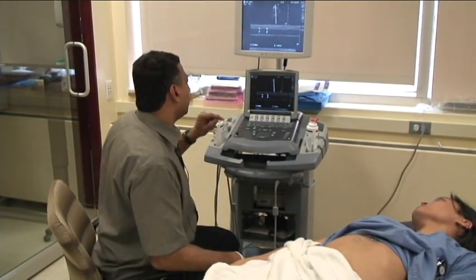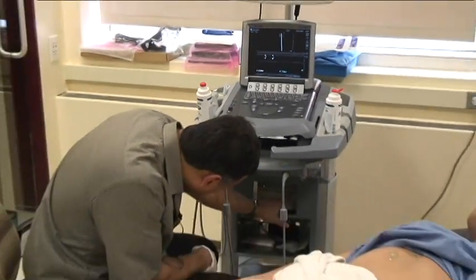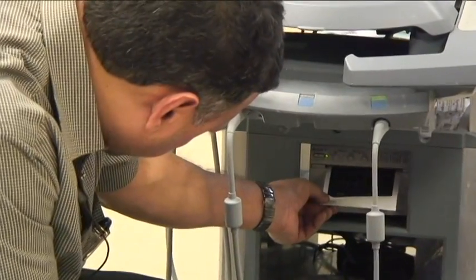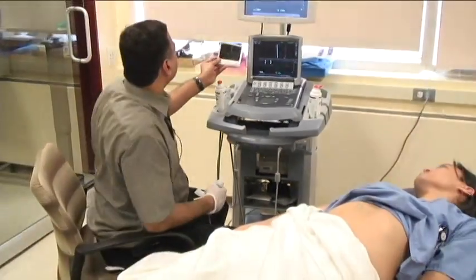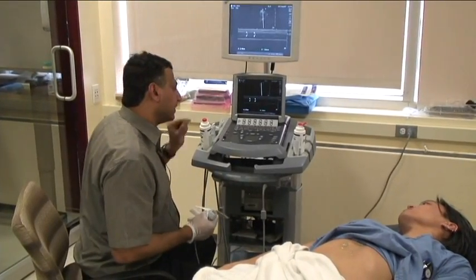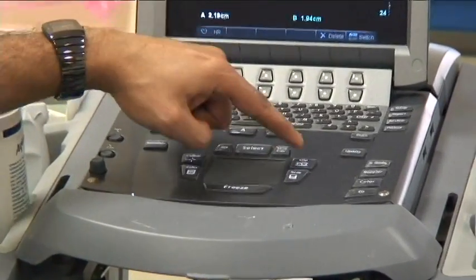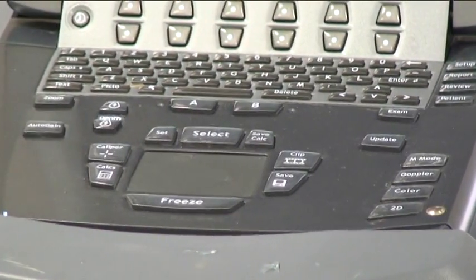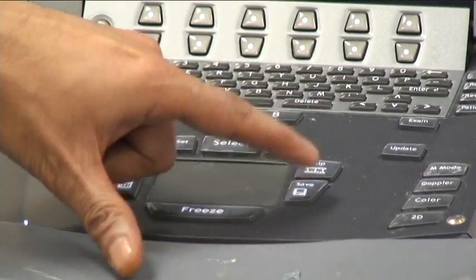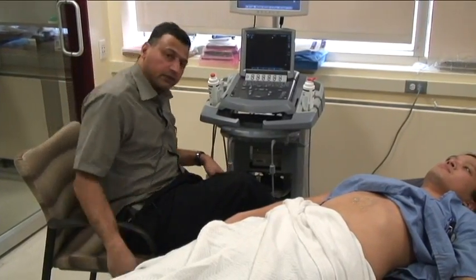Once you have the image here, if you want to print it, you can either save the image or you can print the image. We have a printer hooked up here. All you have to do is hit the print button right here, and you notice this nice image that you get, all printed out, which you can place in the chart to just emphasize the findings that you had. You can also save the image here. You can save an image or save a clip. This is where you save, and where it says clip is where you can save a clip. Clip is usually reserved for 2D images because that's like a video clip, and the image you can save by hitting the floppy icon here.